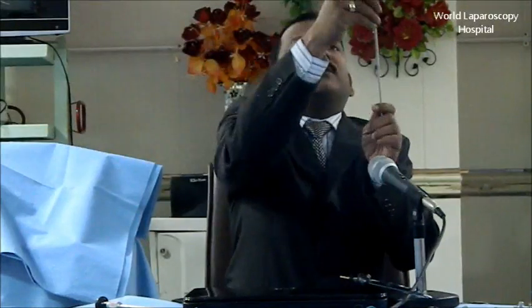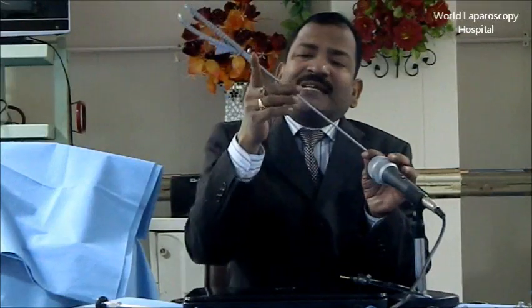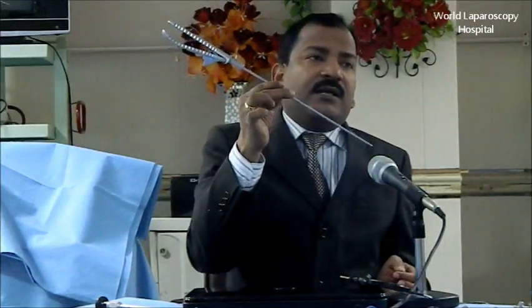Suppose this is the uterus, and I put one port just above the uterus. What is the elevation angle? 90 degrees. In relation to the body of the patient, it is 90 degrees. If I go 18 centimeters away, it will become 30 degrees.